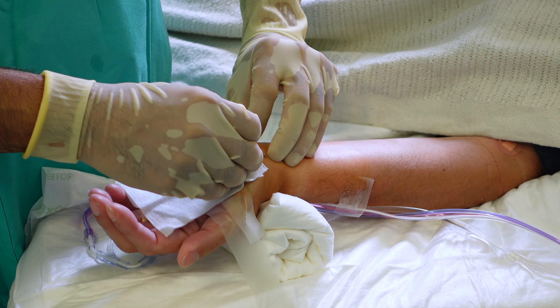Once you've got pulsatile flow, introduce your guide wire. Insert your guide wire into the introducer needle. One end of the guide wire is flexible and the other end is much more stiff, so make sure you introduce the flexible end to avoid damaging the artery. Insert the guide wire through the needle so that you have a good amount in the artery, but ensure that when you remove the needle you can catch it at the skin and never let go of the guide wire. You then thread the cannula over the end of the guide wire, passing it along until you can catch the end of the guide wire behind the cannula, and then thread the cannula all the way into the artery.